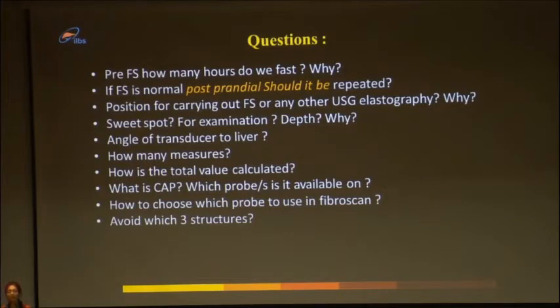And what is CAP? Come on, all your studies are based on CAP. What is CAP? Okay, so sir has already answered. It's controlled attenuation parameter. Which probe is it available on? When we go for Fibroscan, which probe does CAP have? We have to use a particular probe for CAP. And what is the recommended probe for CAP? How many probes are there in Fibroscan?